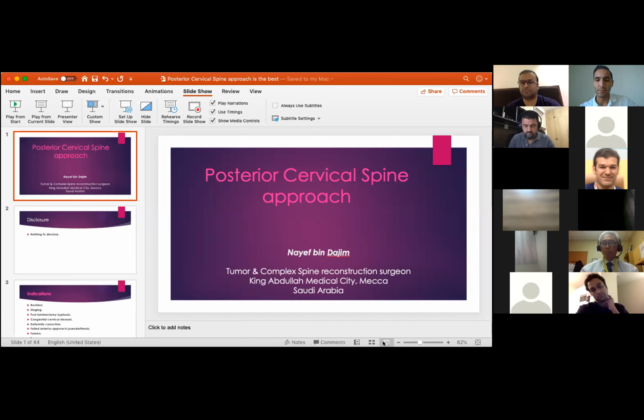Because you used to do the blade for 3 level fusion at a former time, and you stopped doing that. We shifted to the standalone cage and make the cage more anatomically suitable to the disc space after preparation, and we just forgot the blade, and this, in my view, is needed for more than 3 level at least for the stability. I would like to hear your comment, please.